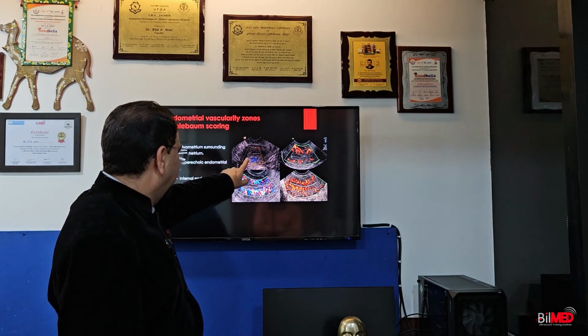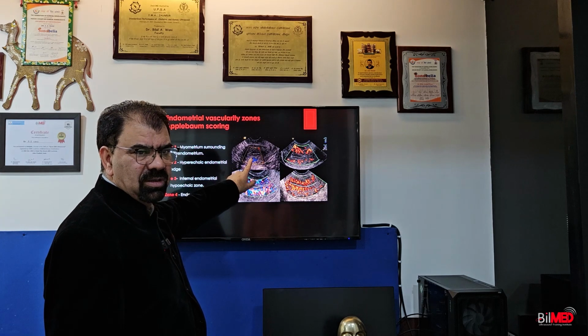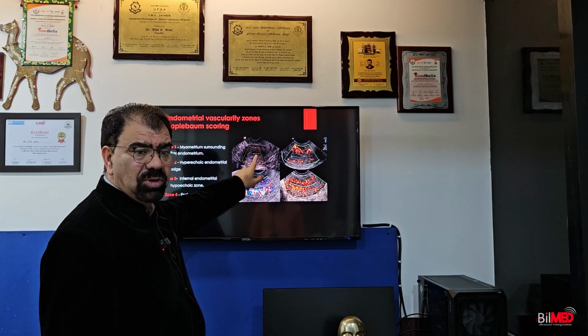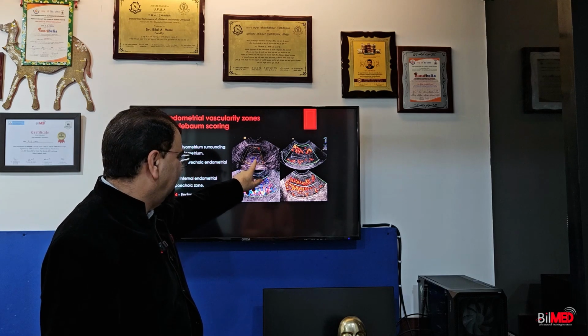This is very, very important in your infertile scan, because if you are dealing with the zone 1 and the blastocyst has dropped into the endometrial cavity, it will never make a connection with the vessels because vessels are very far. That will lead to the abortion. And the more important point is that the patient will not be aware that she has aborted, because this will lead to the menstrual abortion. So see for your zoning.